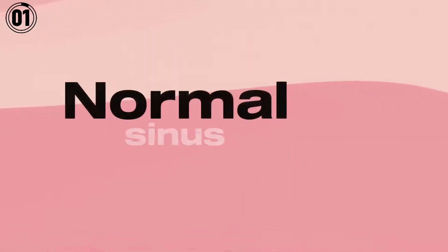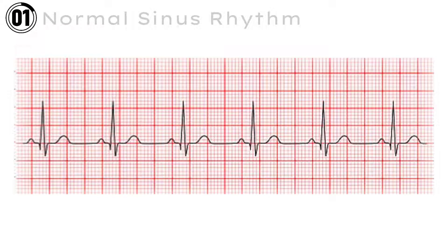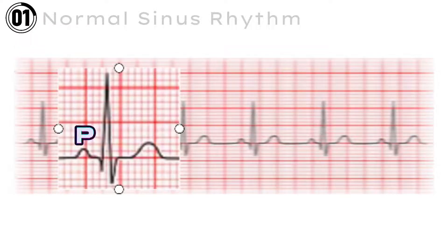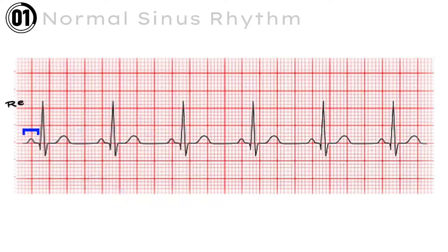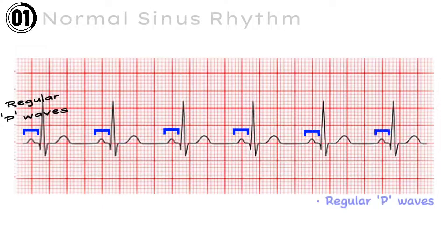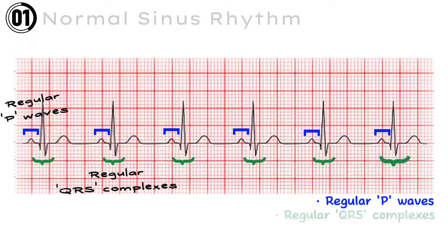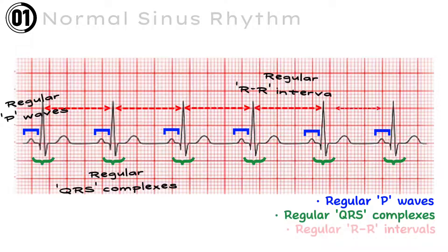Let's start with our first ECG: Normal Sinus Rhythm. A normal sinus rhythm has five waves — P, Q, R, S, and T. There are regular P waves, which are followed by regular QRS complexes, and regular RR intervals.